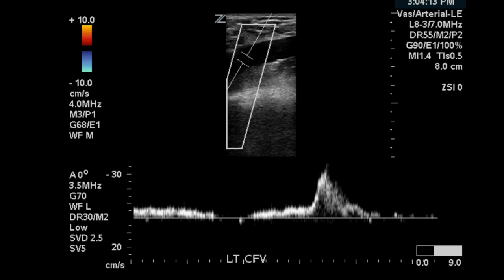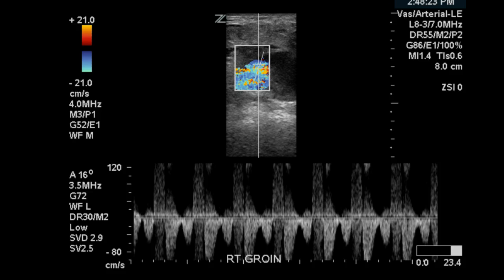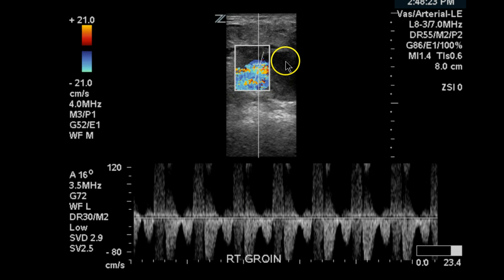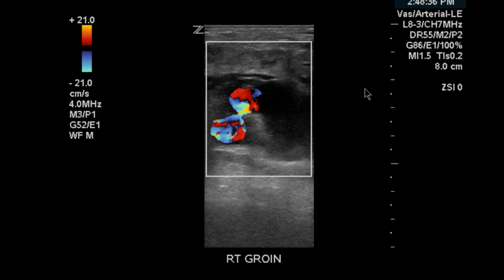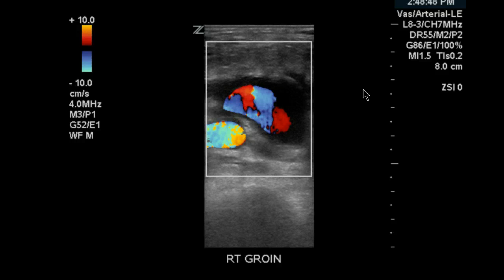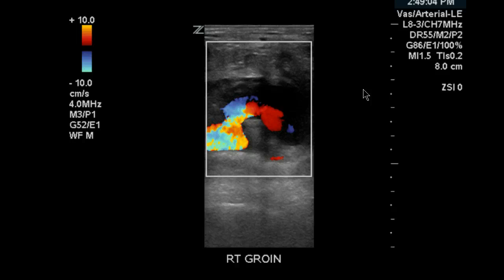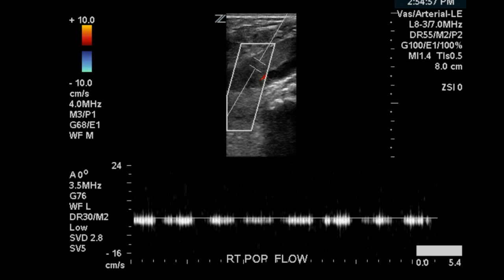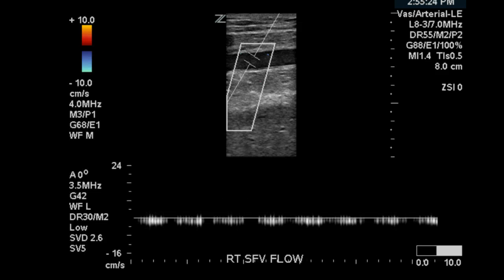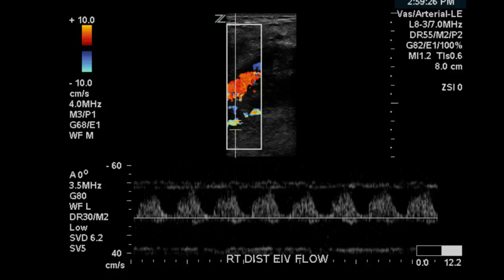So what can we say about this study? First, it is obvious that there is a pseudoaneurysm. We have the classic to-fro flow patterns at the right groin, with a communication of the SFA with the encapsulated hematoma — or PSA — at the neck. That is clear. However, because of the flow patterns we found in the popliteal, femoral vein, common femoral vein, and iliac veins, we are also concerned that there is likely a fistulization that has occurred between the artery and the vein.